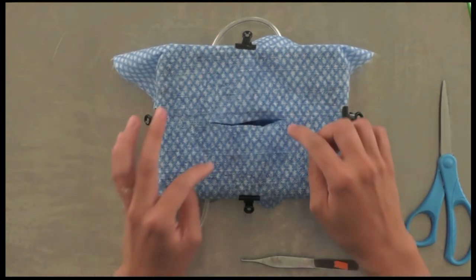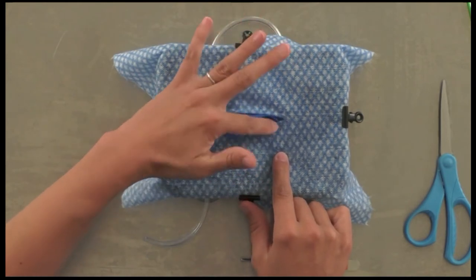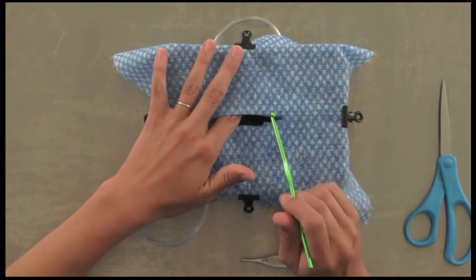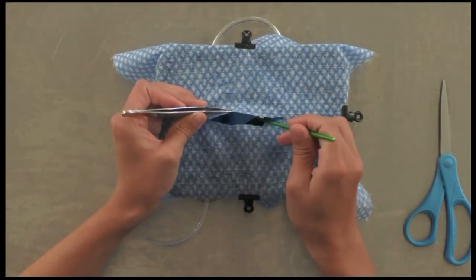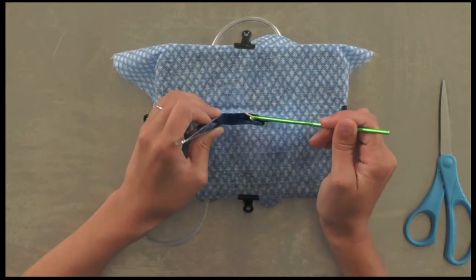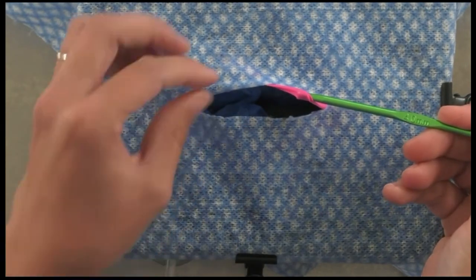You've made a hole in the middle third of your tray. Insert your fingers and push the abdominal contents cranially to get them out of the way of the reproductive tract. Then use your spay hook or crochet hook, lift up the body wall with your thumb forceps, and bring the abdominal contents out to the incision. If you've got something that's not the uterus, put it back; if you've got the uterus, you're golden.